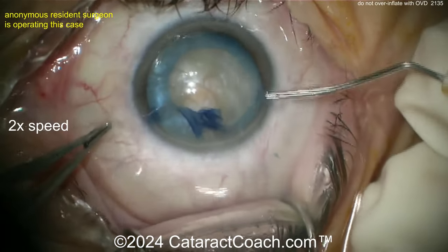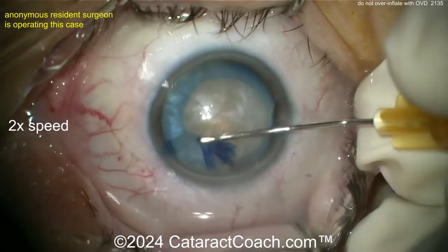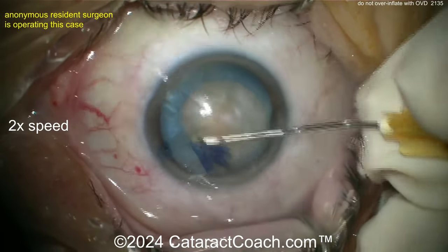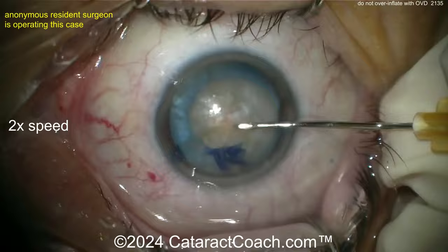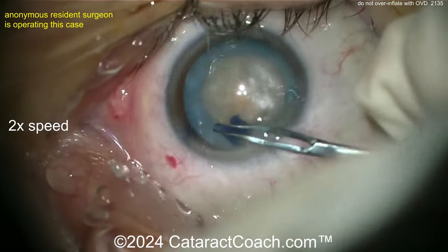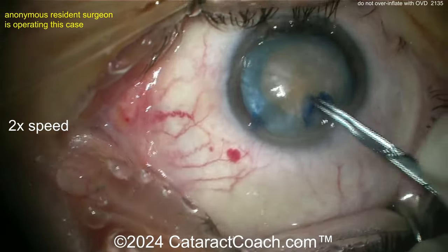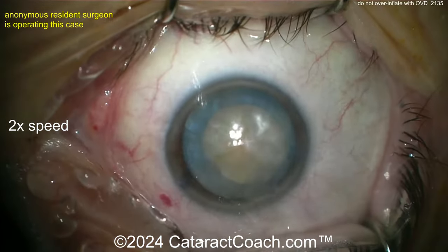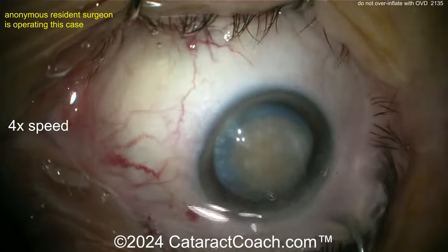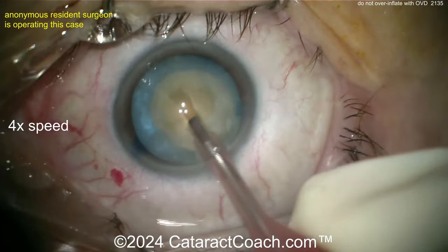Now what? Try to go through the side port. Try to cut the capsule now. But it's already run out to the zonular support — so what are you going to do now? The challenge in doing the cataract surgery is if you put stress on that bag where you have the radialized capsule, it's going to run out to the equator and then put more pressure on the posterior capsule. The issue here was injecting too much viscoelastic.